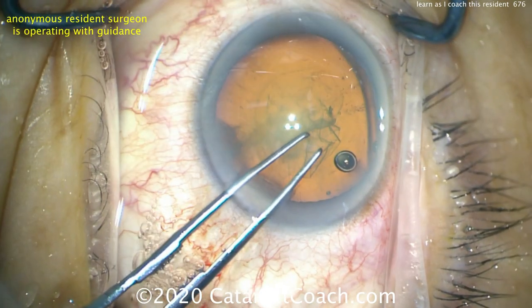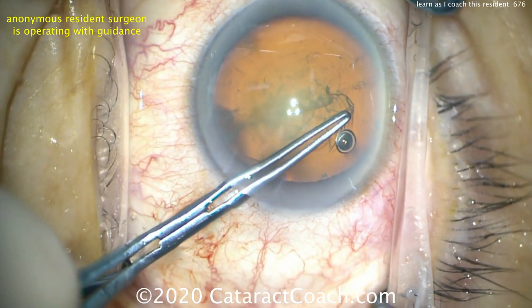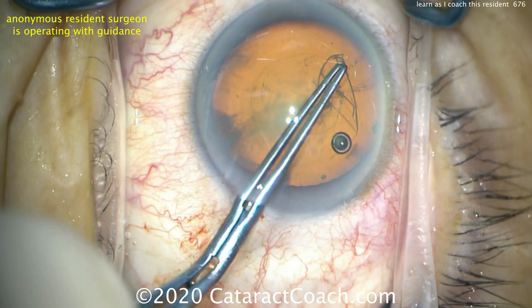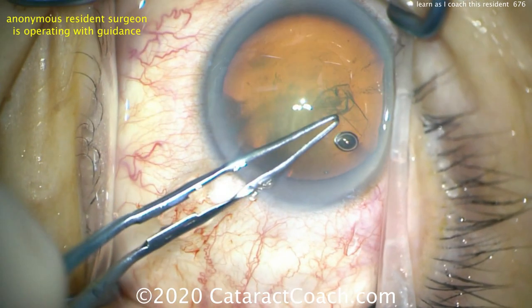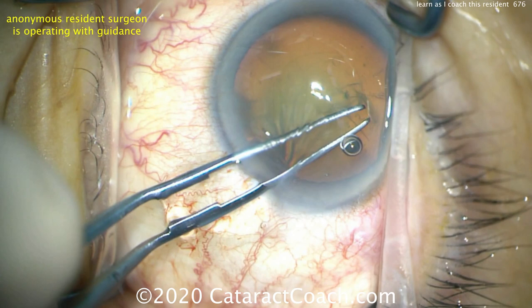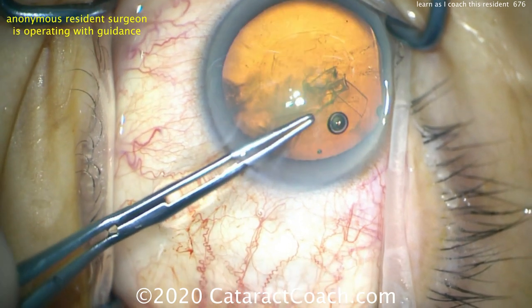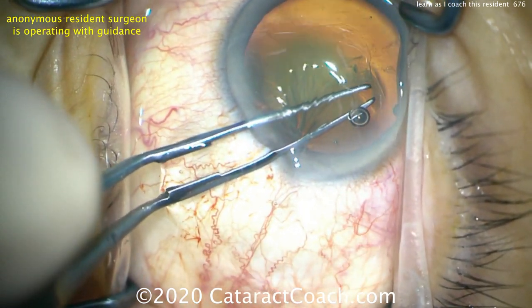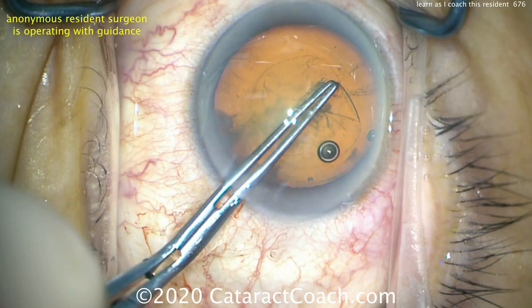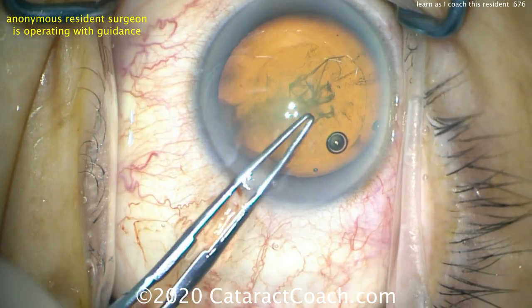This is going to be about a 5mm capsulorhexis, which would be ideal in this case. So pivot down, grab it. Beautiful. Bring it around. Now keep pivoting. Great, doing a great job. Now move around the eye with the instrument closed so you don't gape the incision. Re-grab that capsule now — pivot down to grab it. Pivot down a little bit more; you don't have it just yet. Change the angle, now pivot down, grab it. Very nice. Bring it around. Keep the rhexis tight, keep it the same size. Looks great — you're in the home stretch, just finish this up.